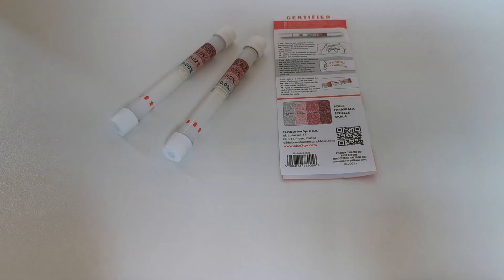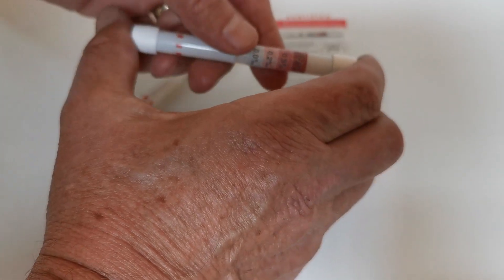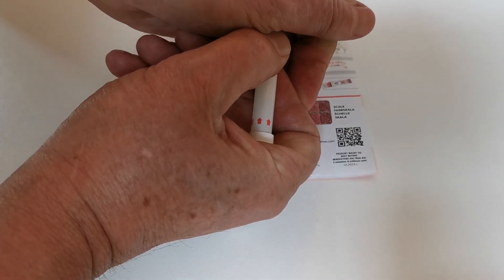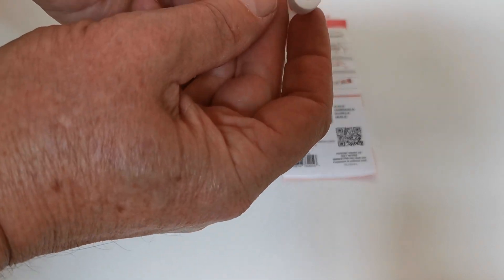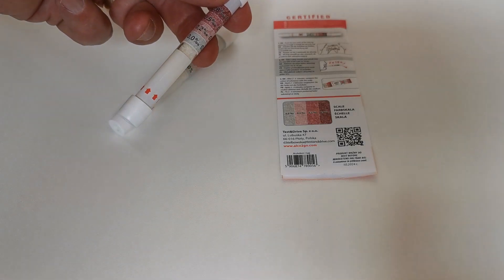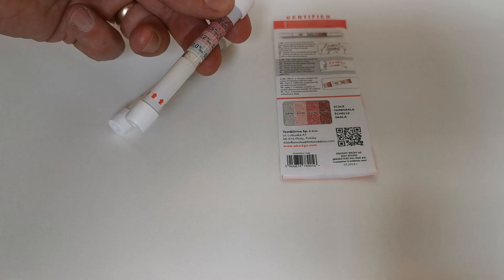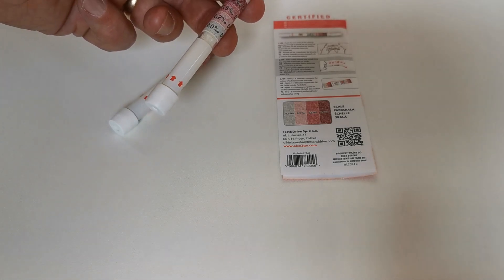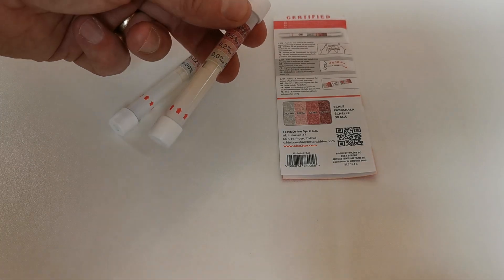To perform one of these breathalysers, when you're ready to do the test, take the test tube and compress both ends simultaneously. Quite a firm pressure is required. You can then see they are open, and then the tube is given to the donor. You ask them to take one deep breath and then blow for two times 10 seconds — so one deep breath and exhale for 10 seconds, then a further deep breath and exhale for 10 seconds.